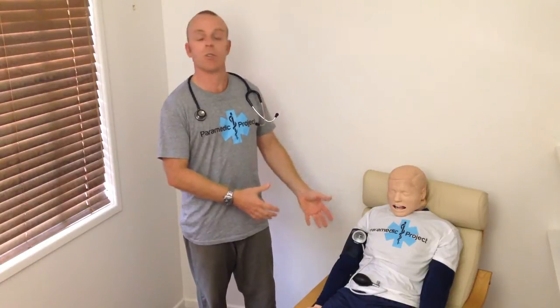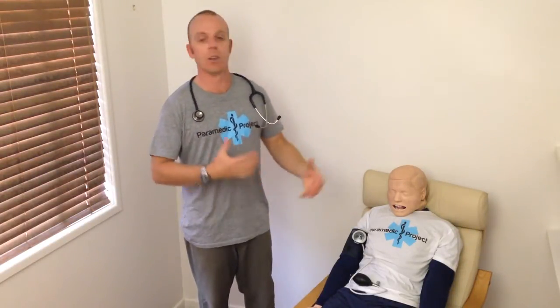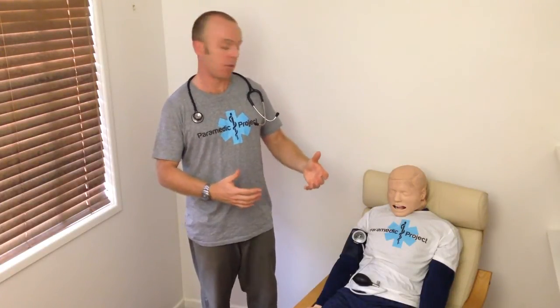So you really need to master the art of taking a manual blood pressure. The manual blood pressure also forces us to touch the patient, and touching the patient allows us to feel their skin temperature, how moist they are — and that's going to give us a really good indication about their peripheral perfusion and their perfusion status before we even get the numbers back.